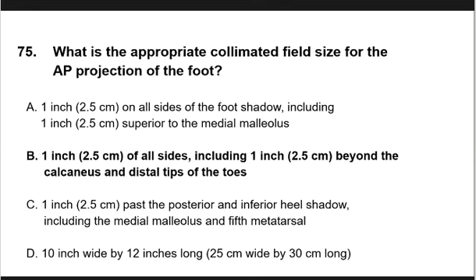So sa AP projection of the foot, meron tayong dalawang klase, di ba? Normally, kung ang i-demonstrate natin is the entire foot, pag sinabi nating entire foot, that is from phalanges, the metatarsals, and all the tarsal bones, that is where we angle the tube by 10 to 15 degrees cephalad. Diba? So if we are going to demonstrate the entire foot, then the central ray is angled by 10 to 15 degrees cephalad.